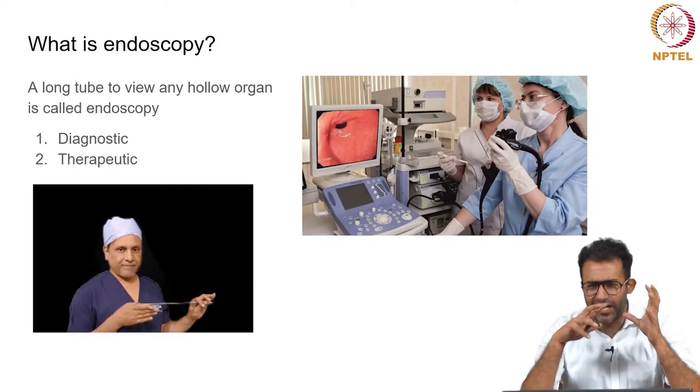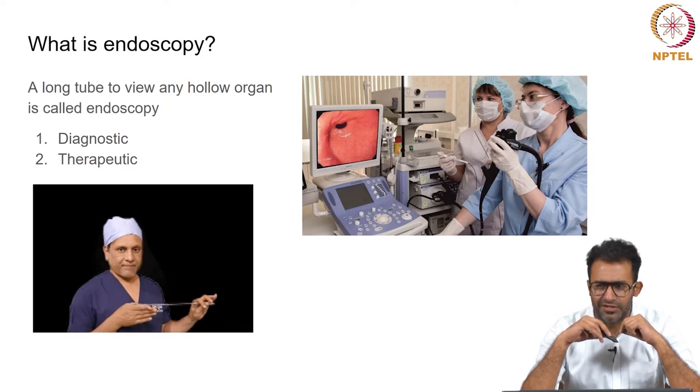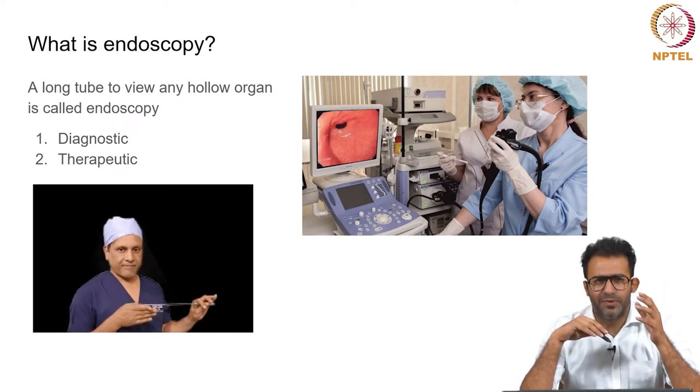There has been a lot of hype, a lot of misconceptions regarding endoscopy. People imagine a scary looking surgeon with sharp instruments poking holes into wherever sharp stuff is not supposed to go. But it's not as scary. It's one of the most commonly done procedures all over the world. And the definition of endoscopy is basically using long tubes to view any hollow organ.